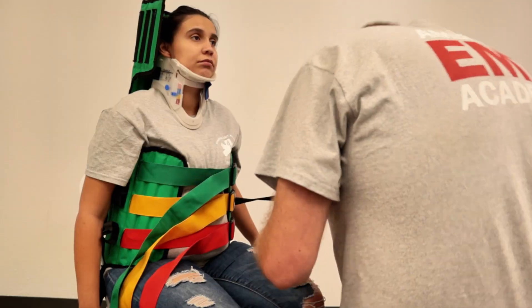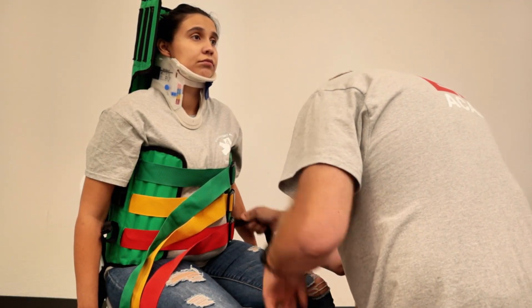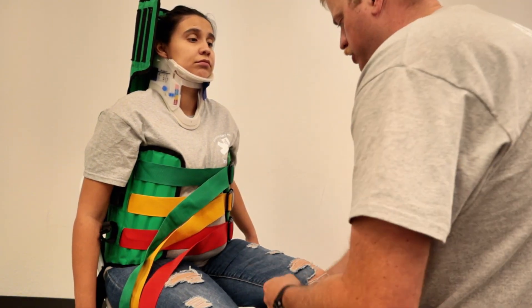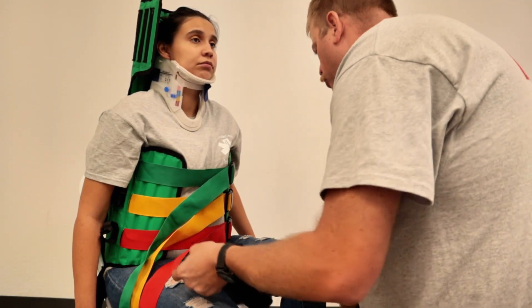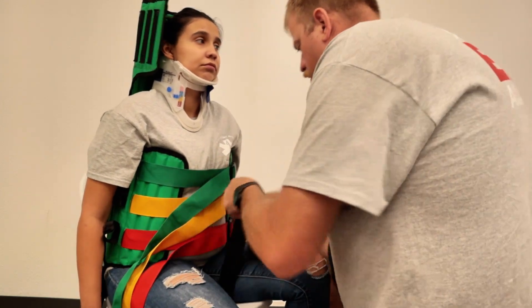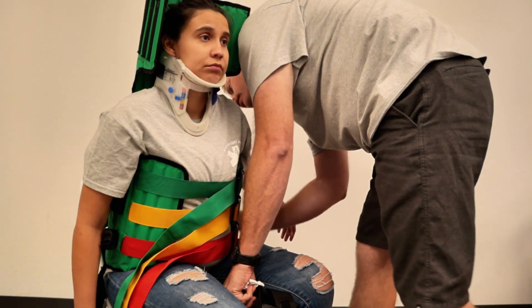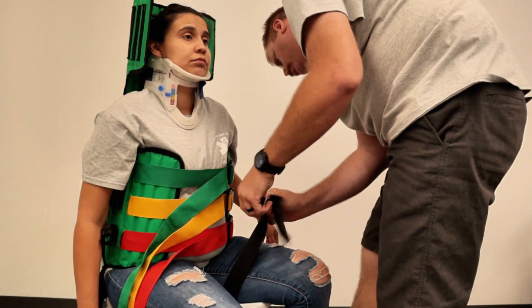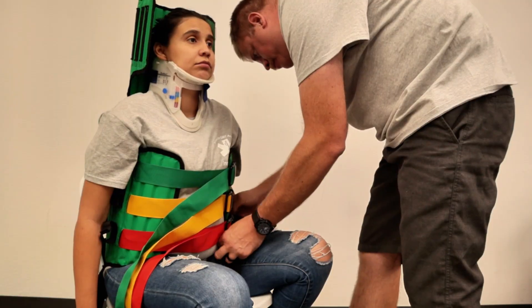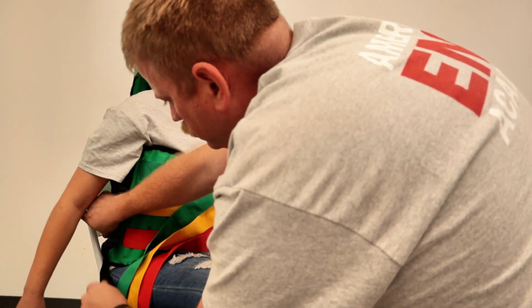Now we take our last two straps and we're going to bring them down around the legs. Make sure they are correctly positioned so they can get clipped in appropriately. Sometimes you may have to slide it back and forth to get it up into position — okay, there we go. We're going to pull and tension. We do the same on this side — make sure your buckle is clear.